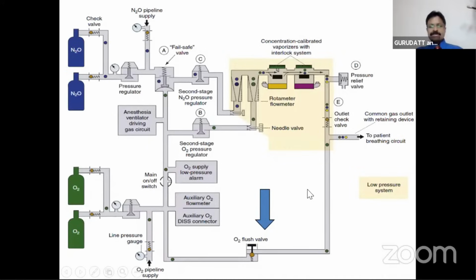You can also use this oxygen flush for checking any leaks in the oxygen machine. I'll be talking about that also. And also you can use this oxygen flush.